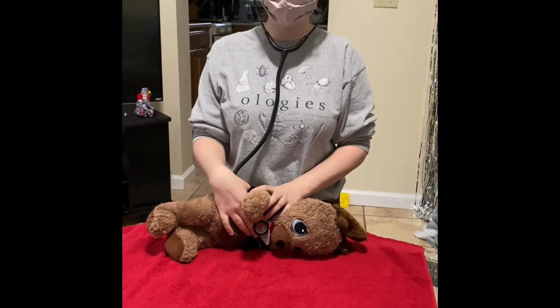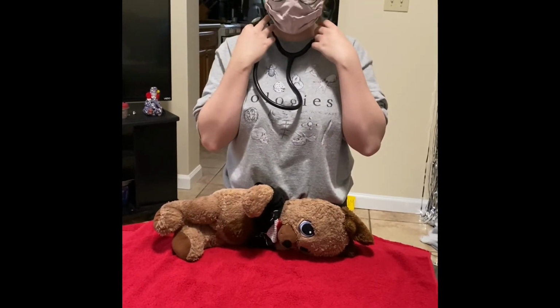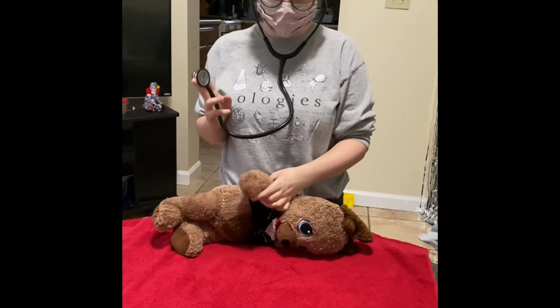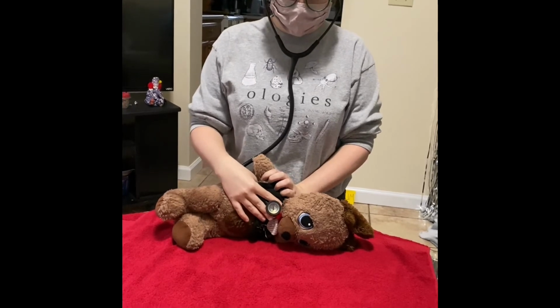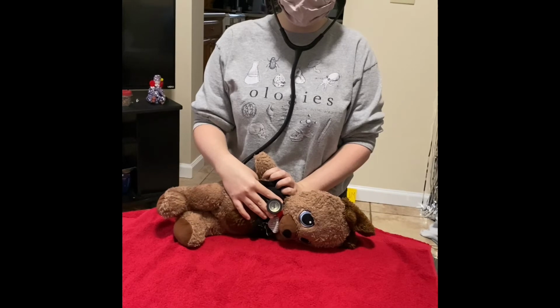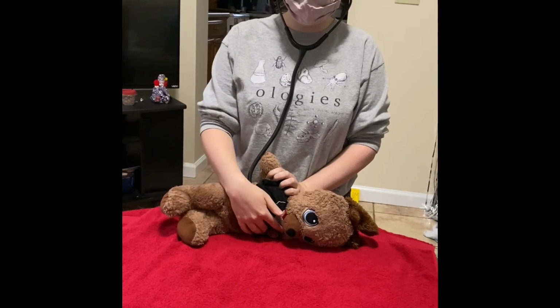And once I'm done getting his respiratory rate, I'm going to auscultate the lungs on both sides of his thorax, listening to all 4 quadrants on both sides. So I'm starting with his right side in the dorsal cranial quadrant. I'm going to be listening for inspiration and expiration sounds before moving on to the ventral cranial quadrant.